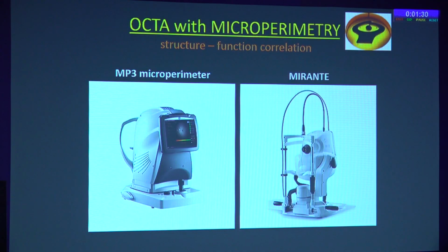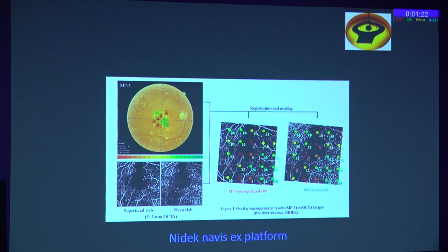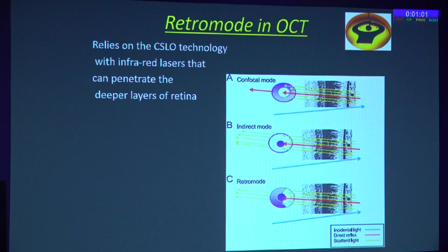And the OCTA can also be incorporated along with the microperimeter. So this MP3 microperimeter software can be integrated with Mirante. And this is the microperimeter taking the central 8 degree microperimetry, and this is the OCTA image. So the one-on-one is getting imported, and the software used is the Nidek NAVIS-EX platform. So it shows the point-to-point structural as well as the functional overview of the macula.